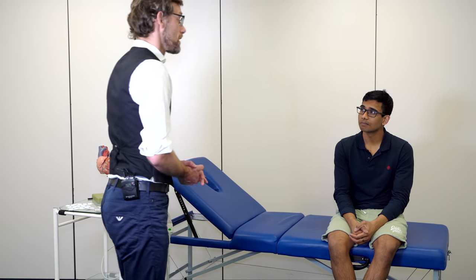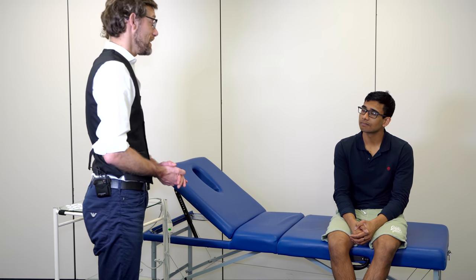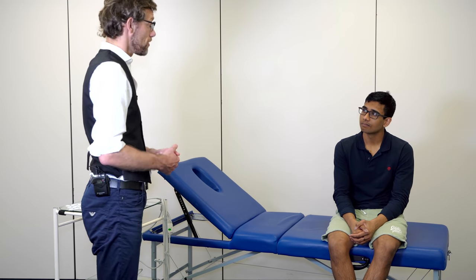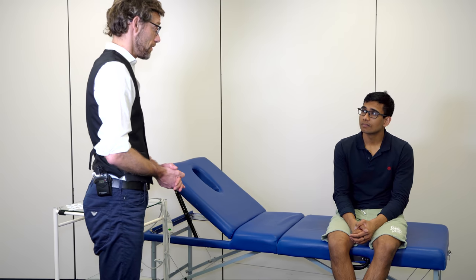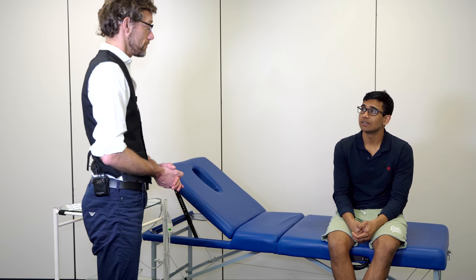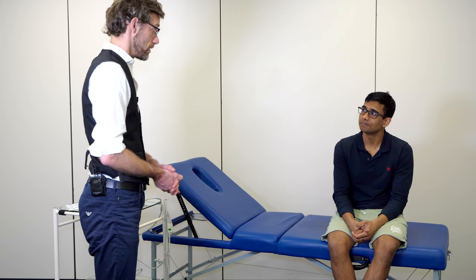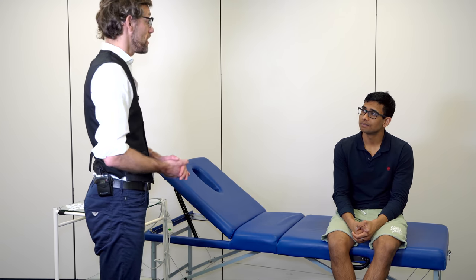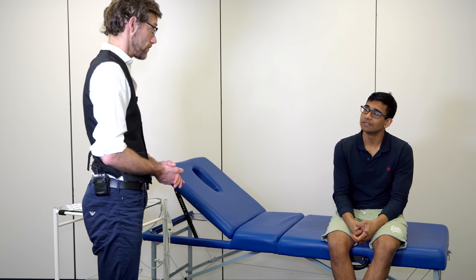My name is Dr Gill and I've been asked to do an ECG for you today. Before we start, could you please confirm your name and date of birth? Mickey Mouse, 22nd of March 1997. Super. Before we go any further, could we just check — do you have any problems with your heart? No.